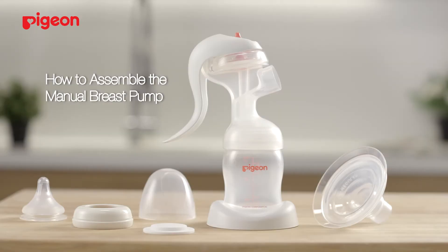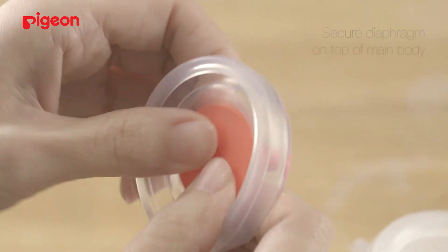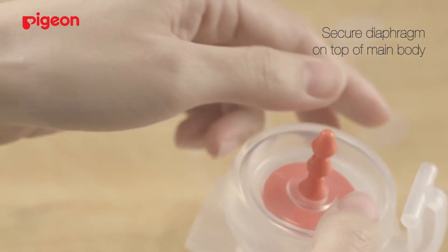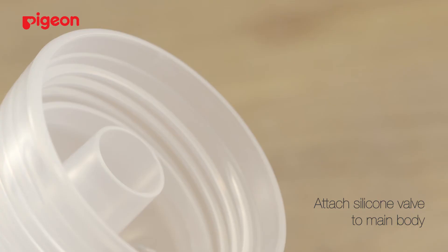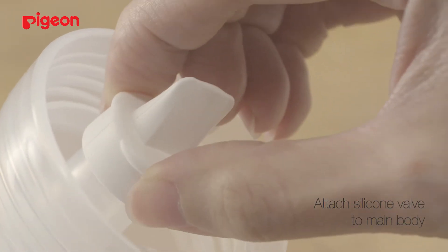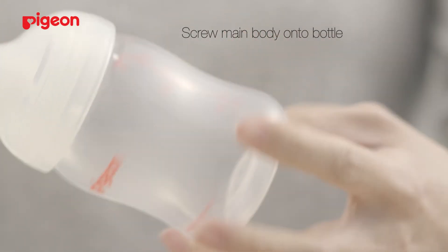For assembling, follow these steps. To begin, insert the stem into the diaphragm. Place the diaphragm on top of the main body and firmly secure it in the groove of the main body. Hold the base of the silicone valve and attach it to the main body. Screw the main body onto the bottle.